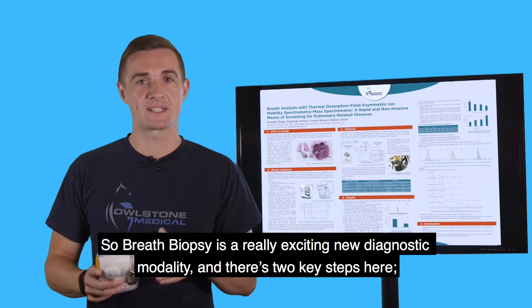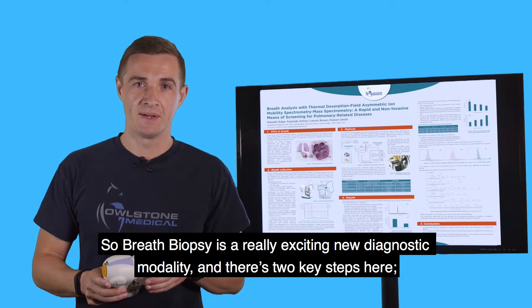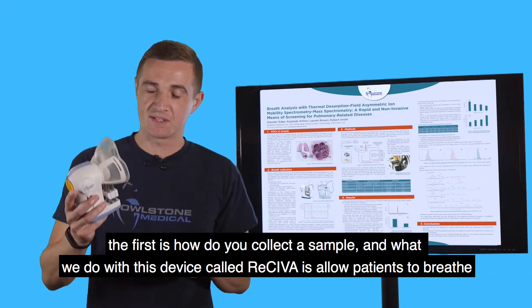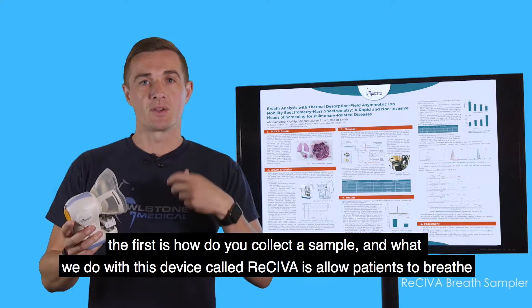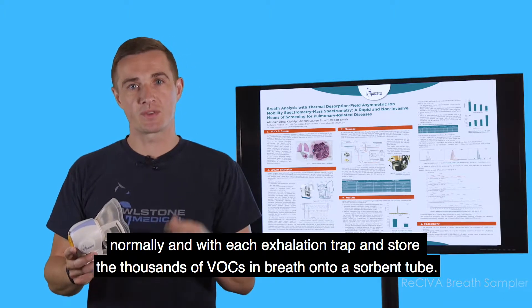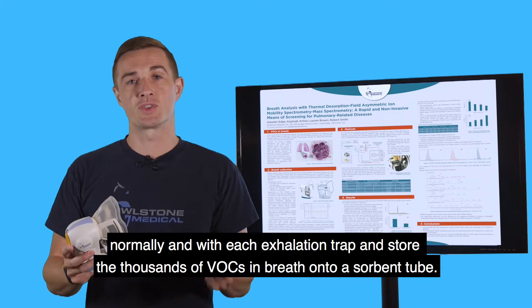Breath biopsy is a really exciting new diagnostic modality and there are two key steps here. The first is how do you collect a sample, and what we do with this device called Receiva is allow patients to breathe normally, and with each exhalation trap and store the thousands of VOCs in breath onto a sorbent tube.